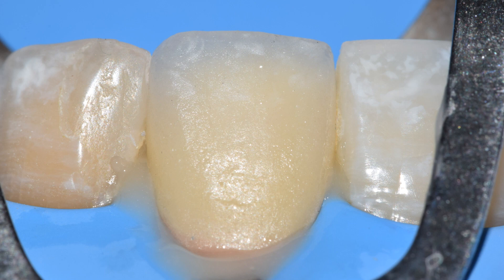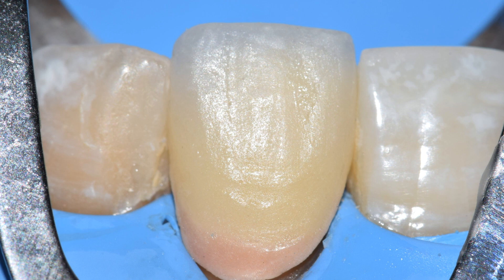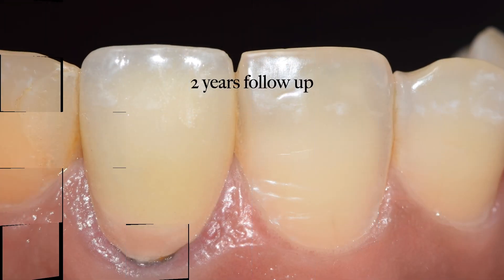Once the material has been set, with the help of any plastic filling instrument or sickle scaler, I am lifting the prosthetic crown. Once the crown has been lifted, all the excess flash is removed and I have this internal core ready, which matches the original core that was done before the prosthetic crown was fabricated. Once the internal core has been fabricated, it is necessary that we do some finishing and polishing — but not too aggressively, because the margins correspond to the prosthetic crown. This is how the final tooth looks. The internal core has been fabricated and it is going to fit exactly according to the intaglio surface of the prosthetic crown. This is a two-year follow-up of the same case.